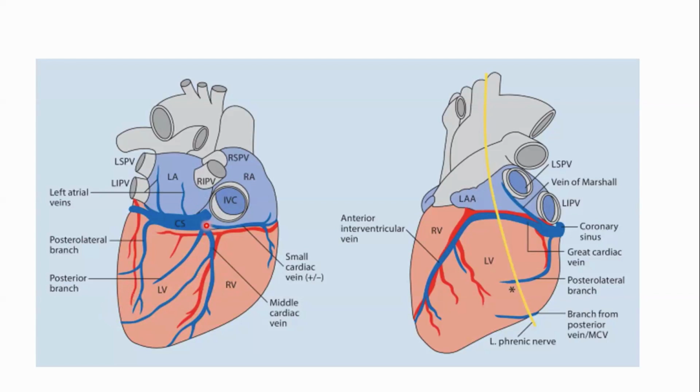So the main body of the coronary sinus, at the point where there's a structure called the valve of Vieussens, now becomes the great cardiac vein that goes towards the lateral aspect of the heart. In between the coronary sinus and the lateral aspect of the heart, there are a variable number of branches that come off. We have various posterior branches, posterolateral branches, and lateral branches. And those are usually the branches that we are targeting when we are looking for ideal anatomy.